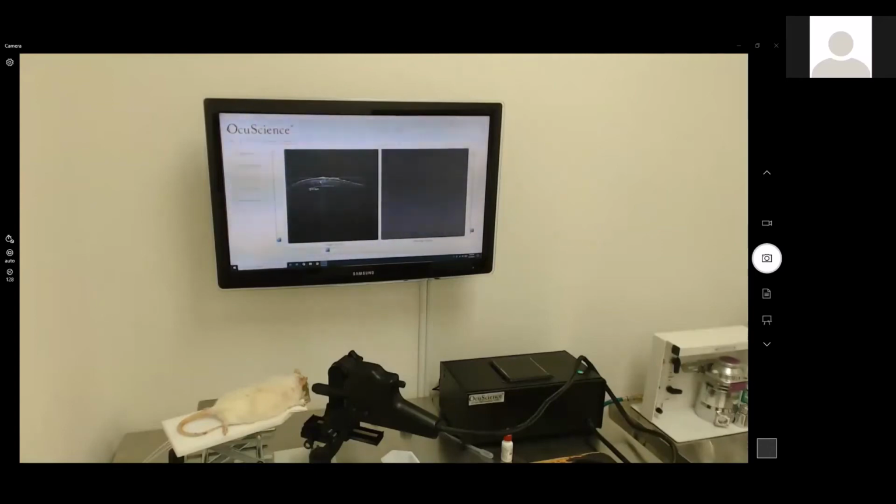What type of analysis do we need? And make that specific to different species as well. Right now we've got a good data collection tool, but the world of doing analysis in detail in different species in OCT is still a wide open area.